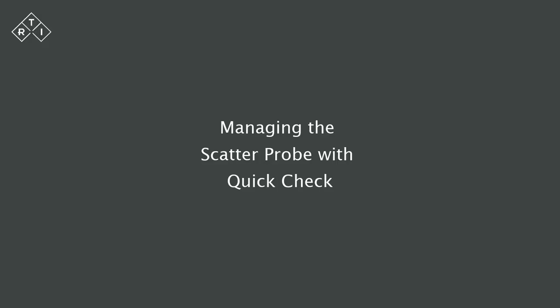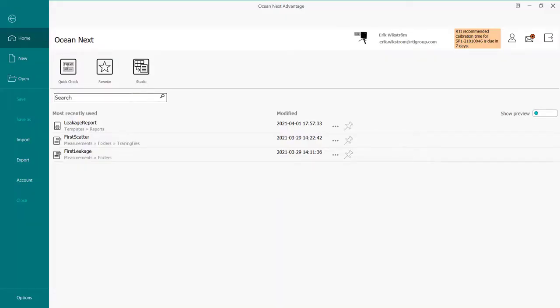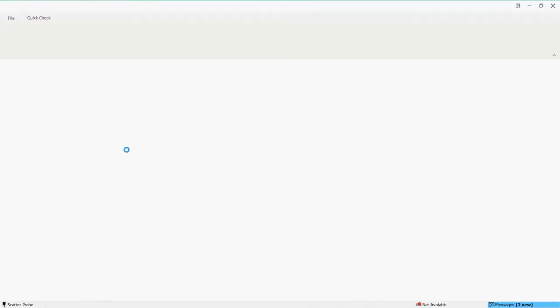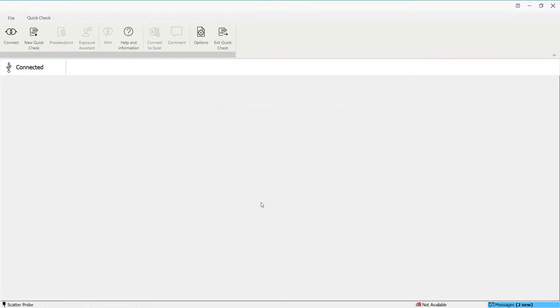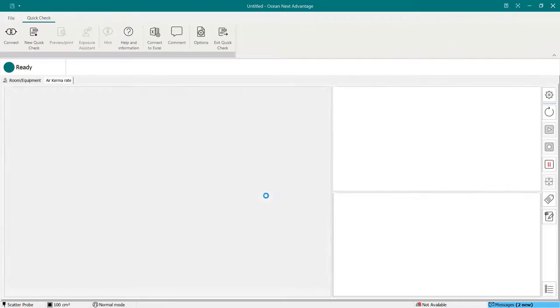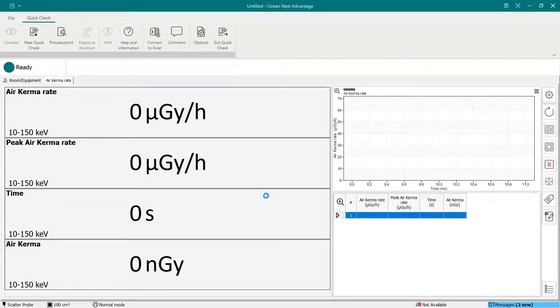To find the suitable configuration for your probe, you can use QuickCheck and the setup there. There you have the choice of measurement scenarios, size of detector, and the view of all the data available.